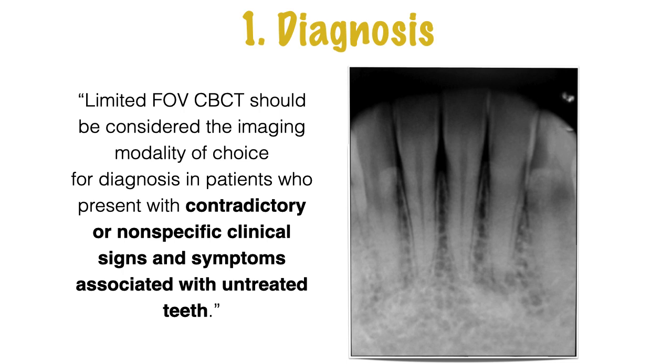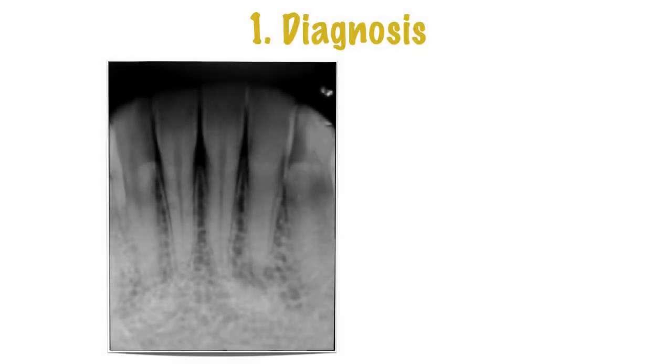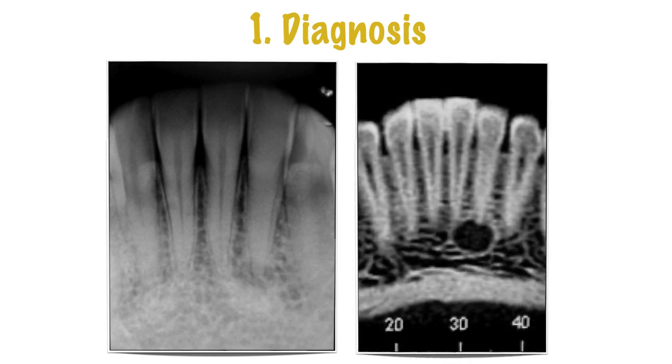Okay, well, the EPT here wasn't quite 80. It wasn't responding to cold, but the canal is calcified. It was tender to percussion, and this was suspicious, so it wasn't 100% clear whether there was an issue with 232 or not. And then the CBCT, this is an older CBCT scan, clearly showed that there was apical radiolucency present there.